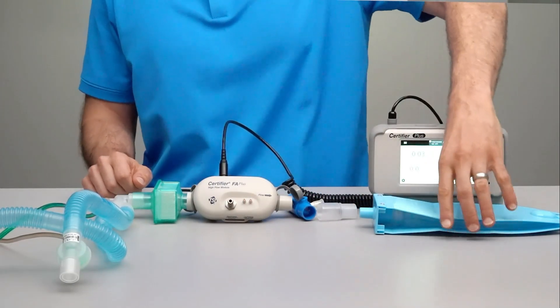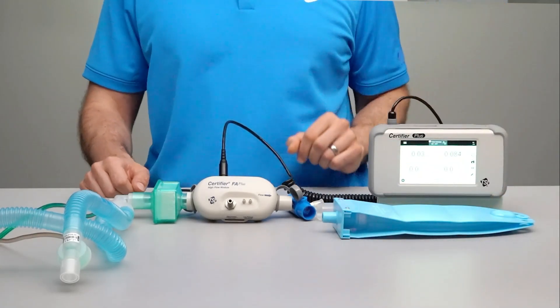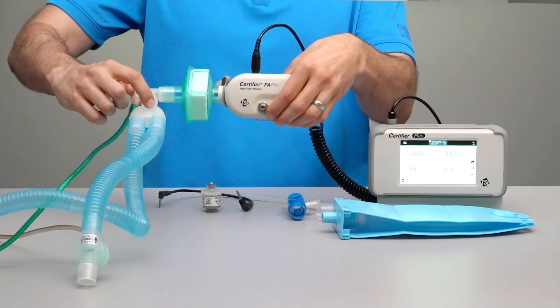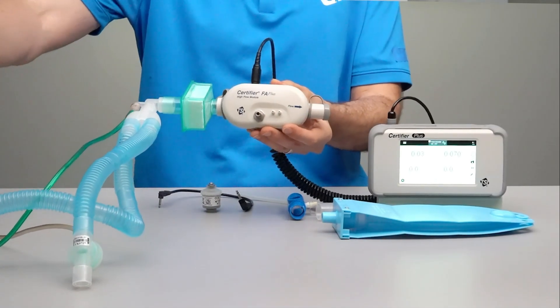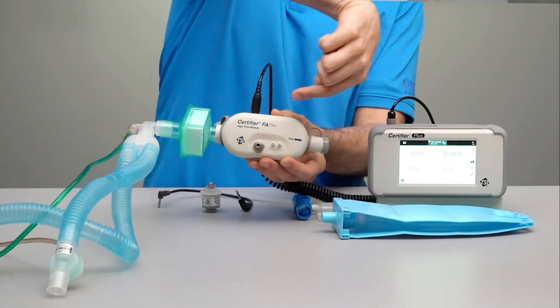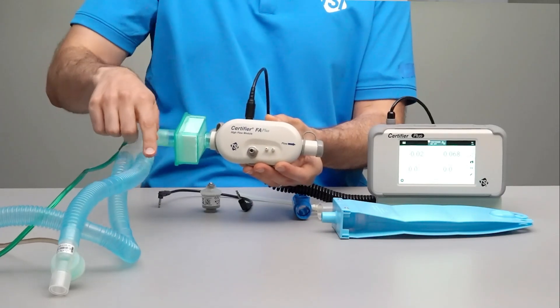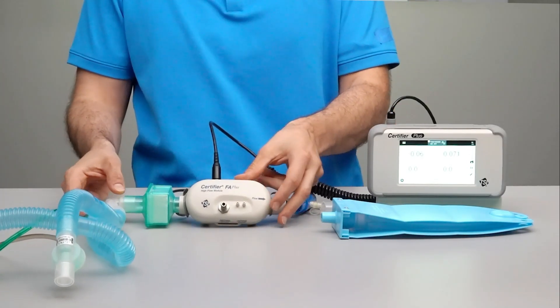A test lung will be connected to the outlet of the flow module. For a bidirectional test setup, the Y fitting needs to be placed before the flow module so that the inspiratory flows come from the ventilator through the Certifier into the test lung and then back through the Certifier as expiratory flows, which then return to the ventilator.